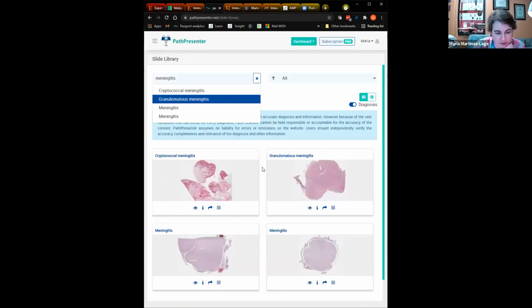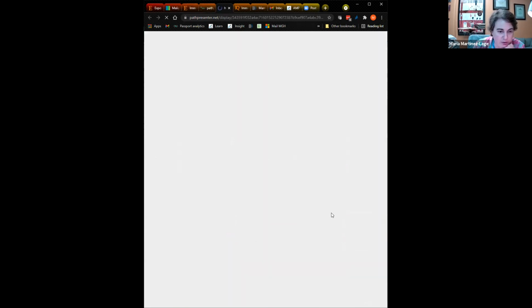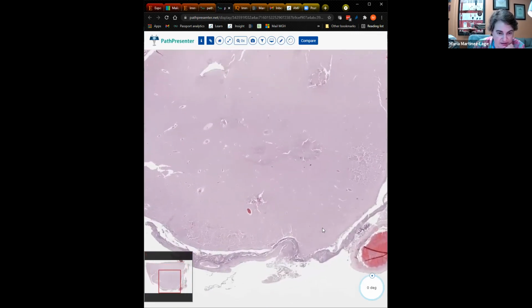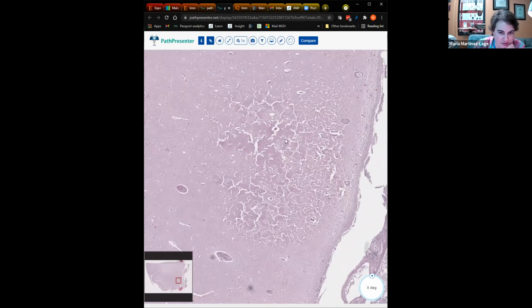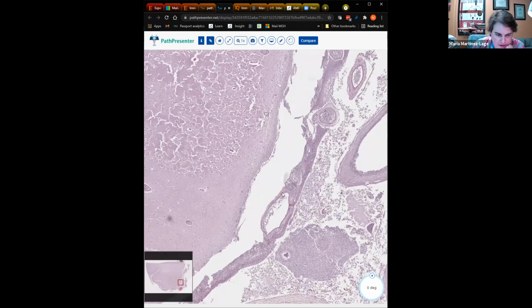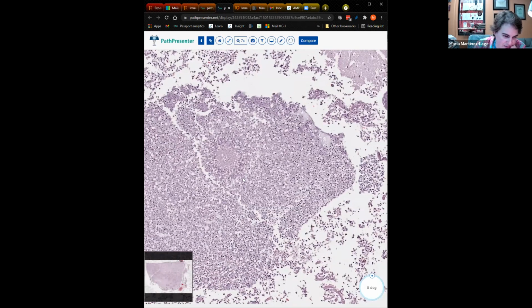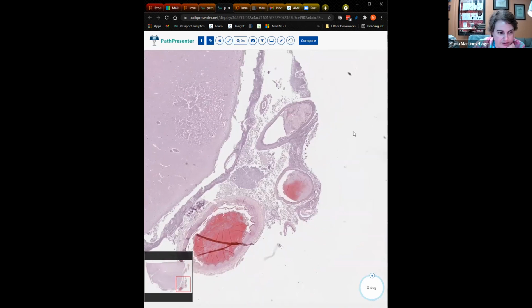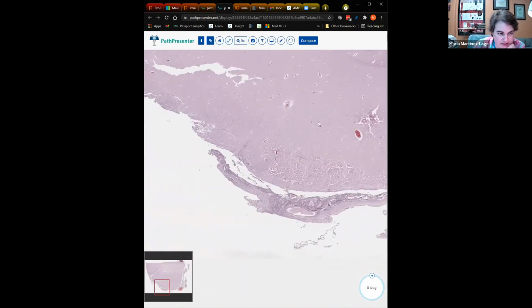So, and again, similarly to what you would do with any other organs, always bring up the possibility that infection is the underlying issue rather than being bold and calling something sarcoidosis. I don't think this is the same case. This is another example of a cellular process that is involving the leptomeninges.